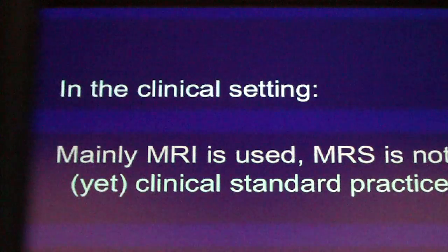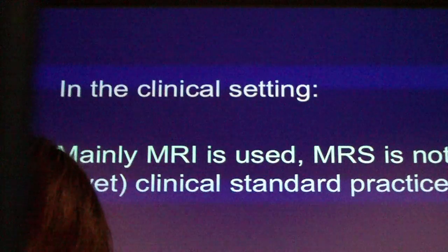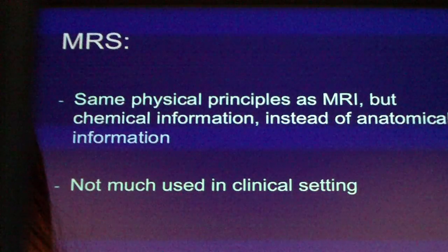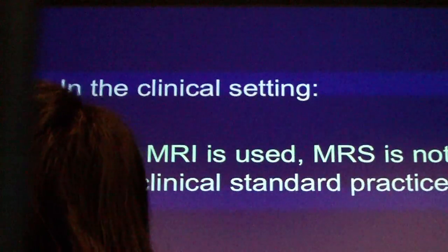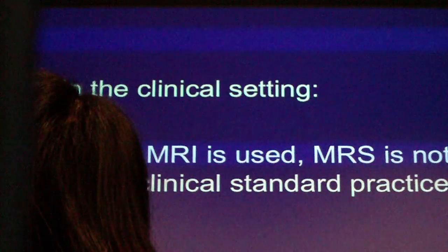Imaging modalities. Okay, so mainly MRI is used. MRS, not really, although it does have the potential. But what I want to say about MRI is that the contrast is based on A, concentration differences, so how many protons are there, and B, very importantly, the relaxation mechanisms in the different tissues.